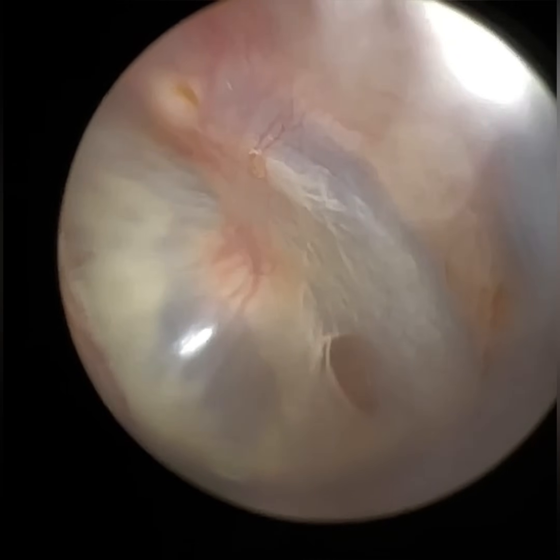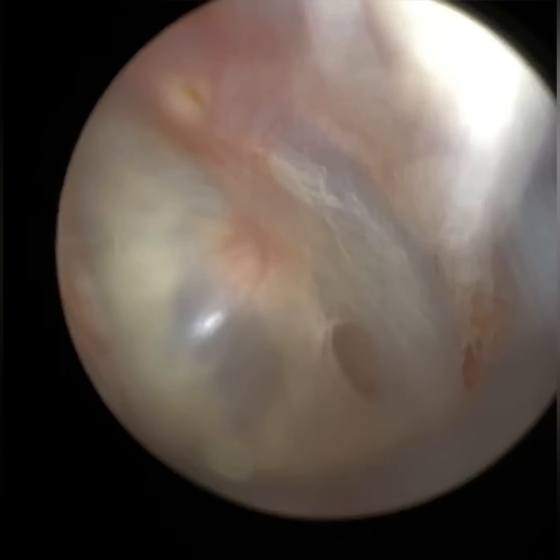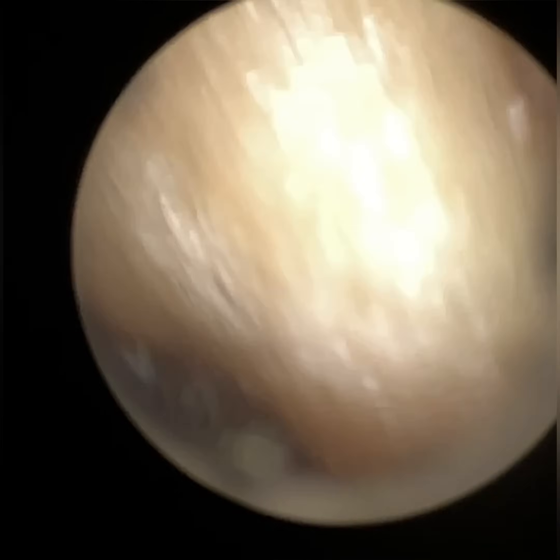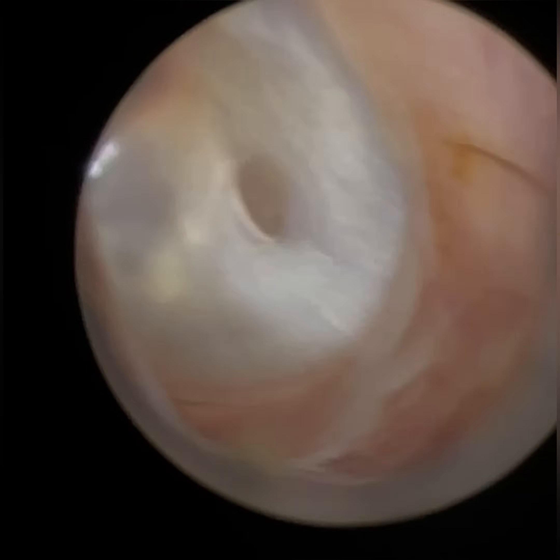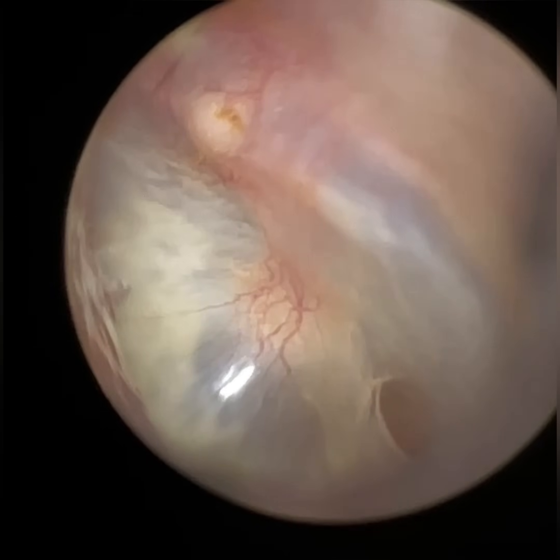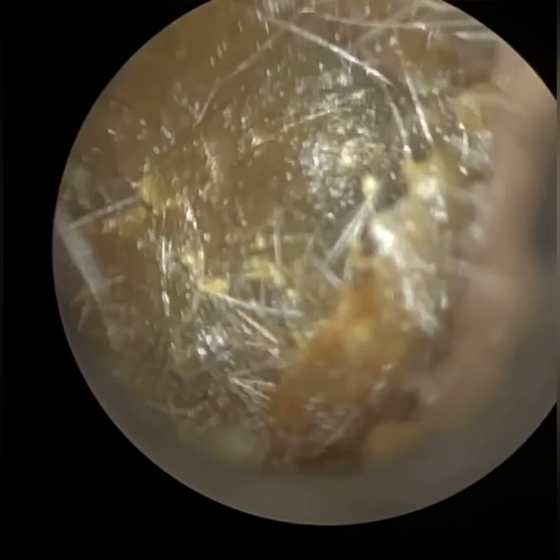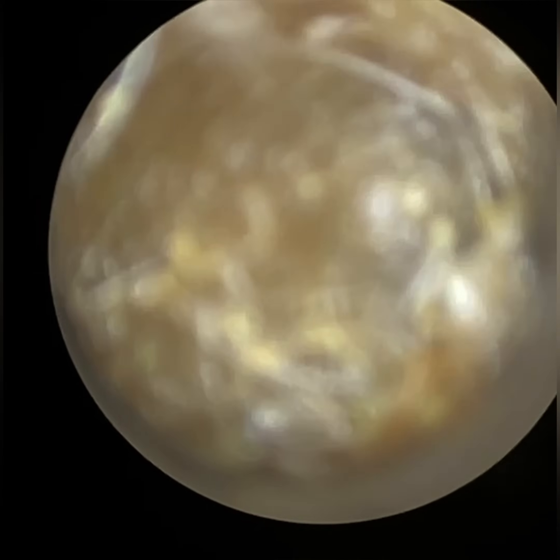I'm just adjusting the focus to get a really good visual here. You can see all the blood vessels and capillaries around the hammer bone. I'm going back in and zooming in as well. That zoom feature is one of the additional features we're developing with our own app. I'm going to use the zoom here to remove some more debris, so do stay tuned for that.